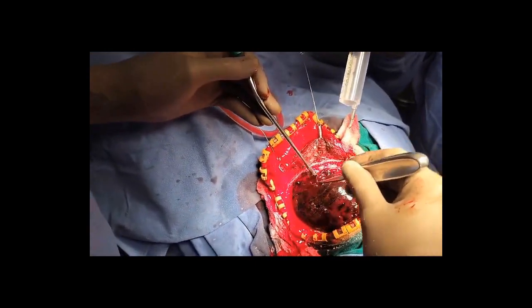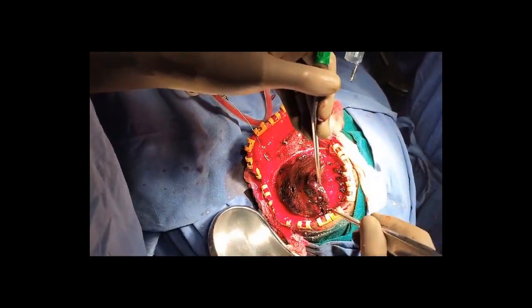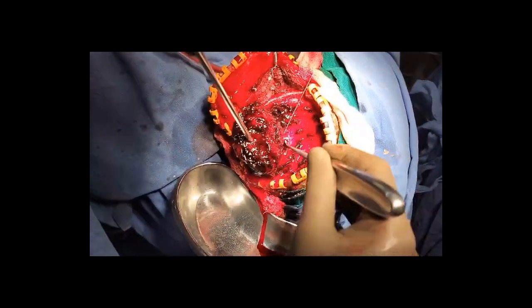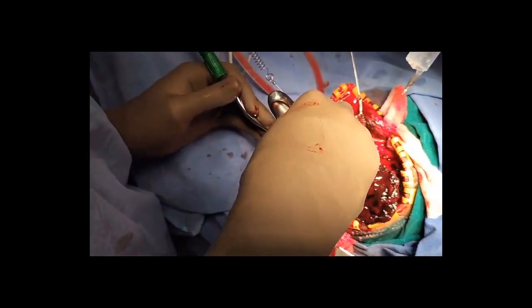And after the scan, there was a huge EDH, and this is what we have done there, a standard square flap, and you can see there the EDH is being evacuated. And once we try to dissect it with the periosteal elevator, you can see a huge clot which has come out, almost looks like our Indian cuisine idli.